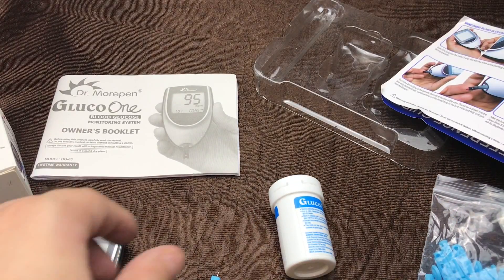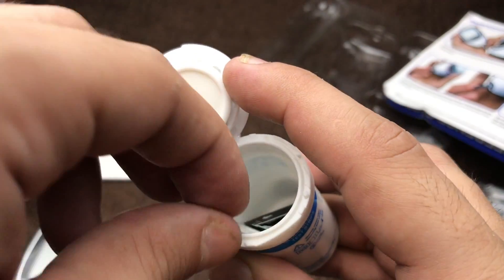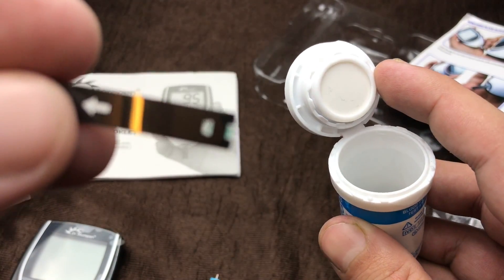These are the sticks you have to use. You have to throw them after use — don't use them again and again, just use it and throw it.